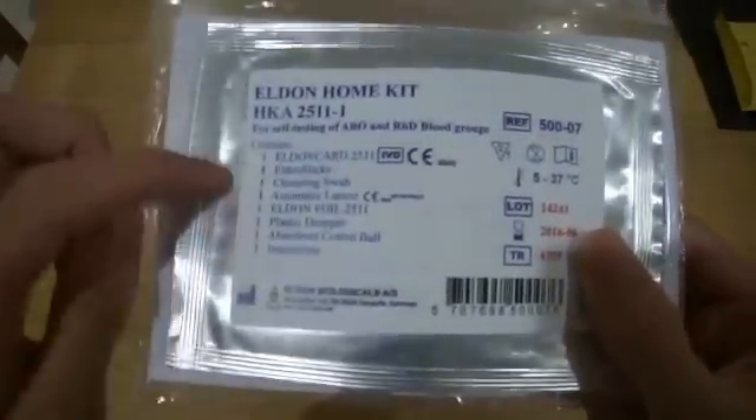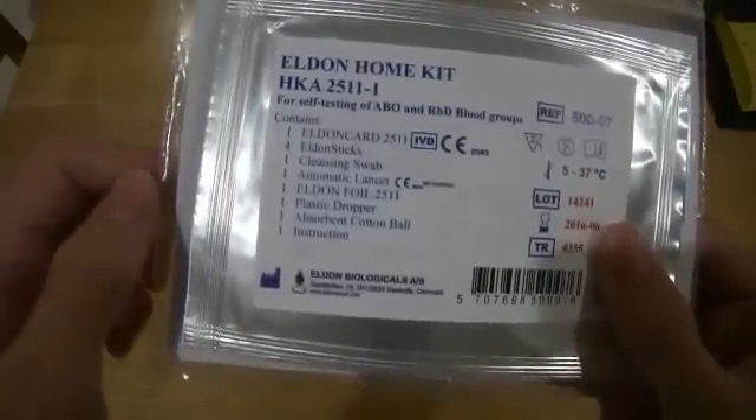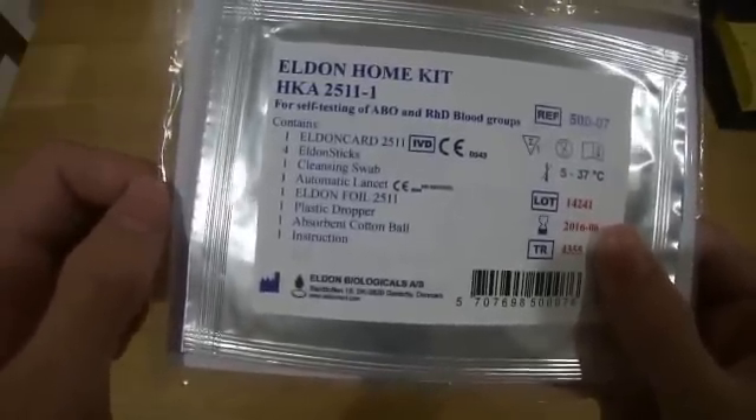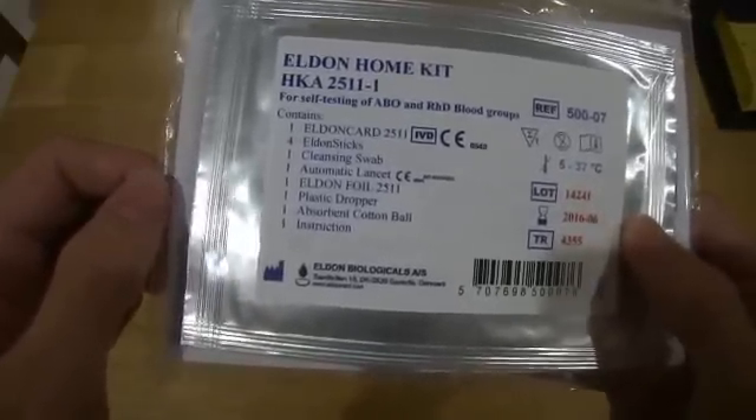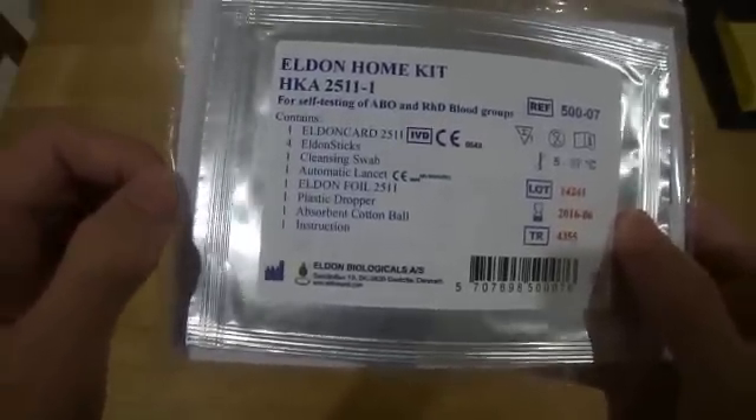It comes with one Eldon card, four Eldon sticks, one cleansing swab, one automatic lancet, an Eldon foil, one plastic dropper, one absorbent cotton ball, and instructions.